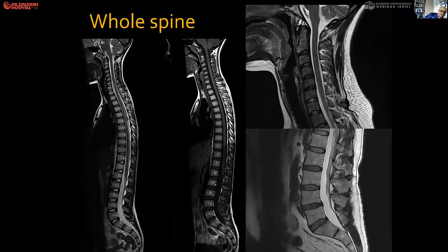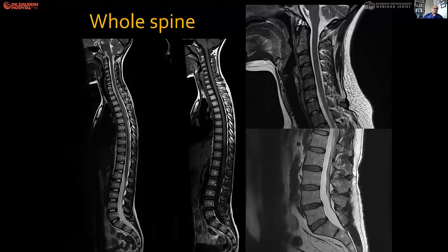This is also called the scout view. The scout view at a glance gives you an idea of pathology. Sometimes I ask for scout views, especially if I'm doing a lumbar stenosis patient, to quickly see if there is concomitant stenosis anywhere. If there was stenosis, we can image that particular area — keeps the cost down. Similarly, you can do it for tumors as well.